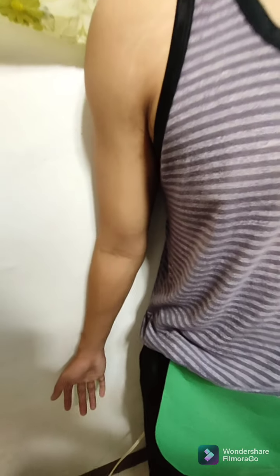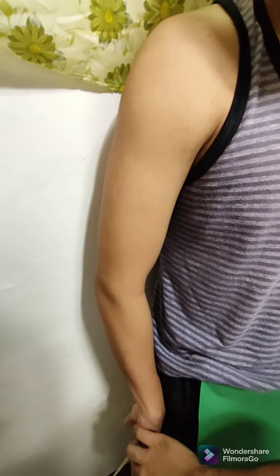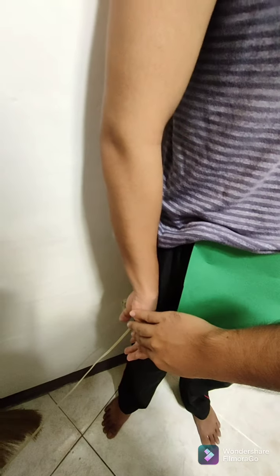So for the next projection is ang internal rotation. So same patient position pa rin, erect. And ask the patient to internally rotate the limb para makakuha tayo ng internal rotation of the shoulder. So dyan po banda sir. I-rest mo lang po dyan banda sa may lap mo. Make sure that the shoulder is placed flatly against the IR to decrease OID.